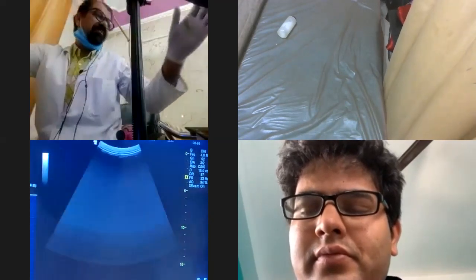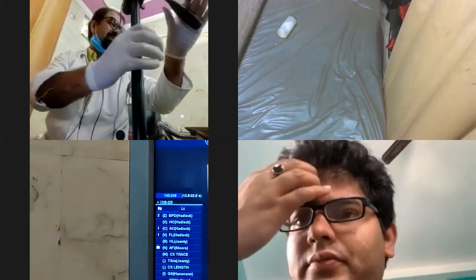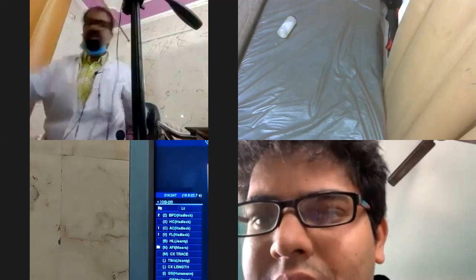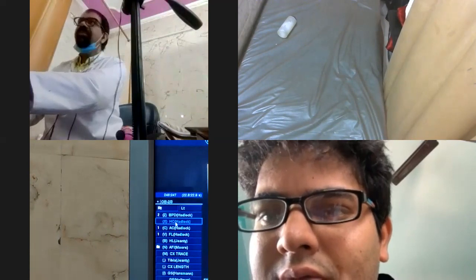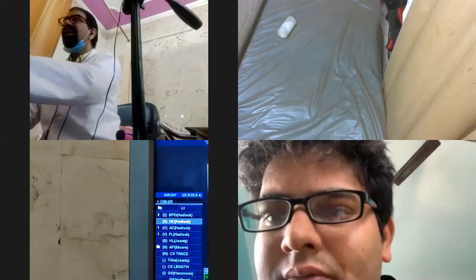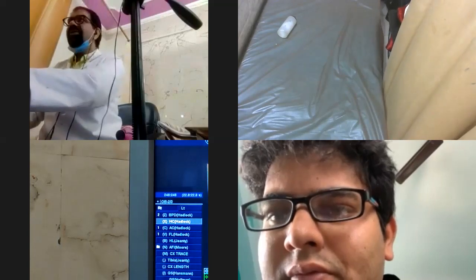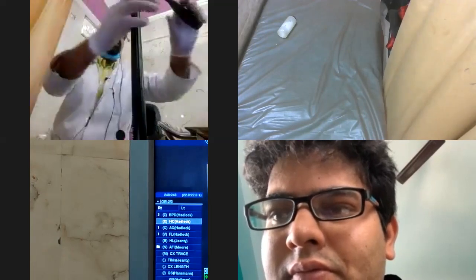Wait. Hold on. Can you see this? This is BPD. This is HC. Yes, sir. This is AC. This is FL. So I have to give BPD. I have to measure the BPD. I have to measure the HC. And whenever I am measuring all of AC, FL, BPD, and HC, then the machine will automatically calculate the fetal weight. How?